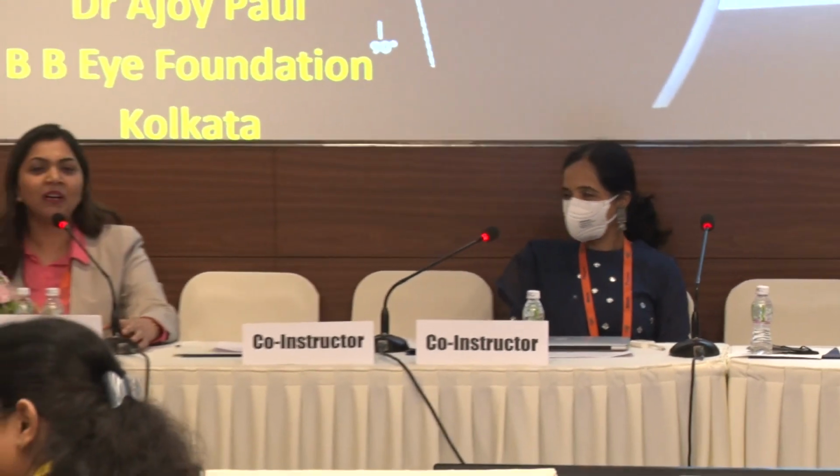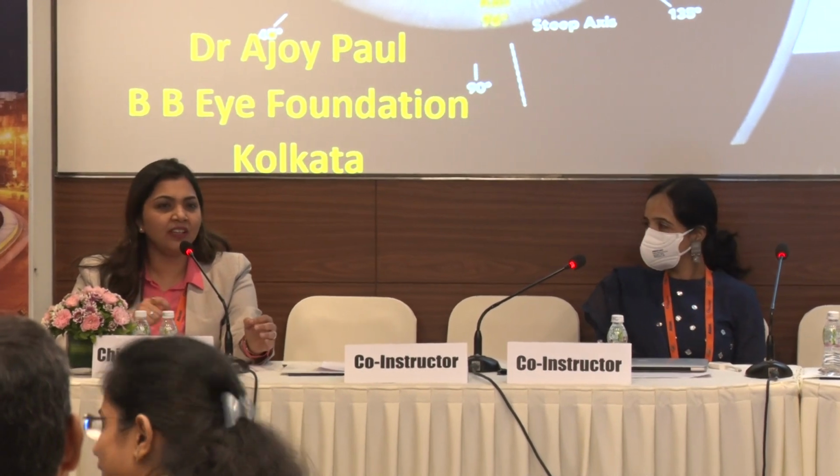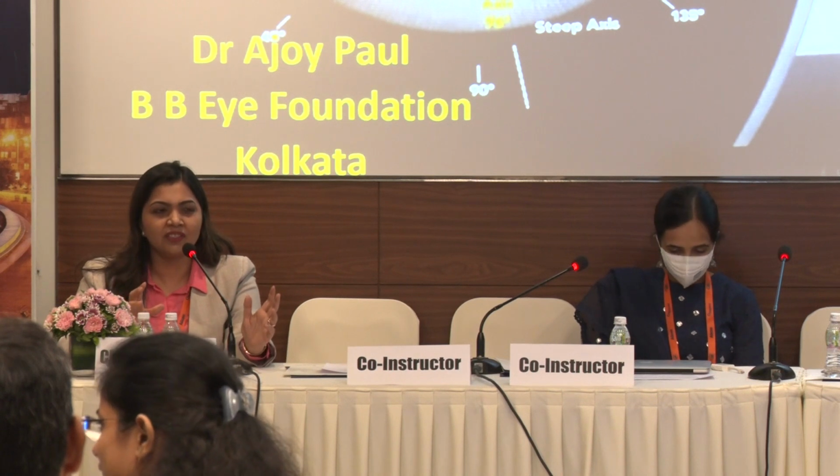Definitely, you can invest in one, one can have a good smartphone. People are going for smartphone photography. So the quality of smartphones definitely is not much of a matter of concern. We can get scleral vessels through it and definitely go for ink marking, if not these scleral vessels.